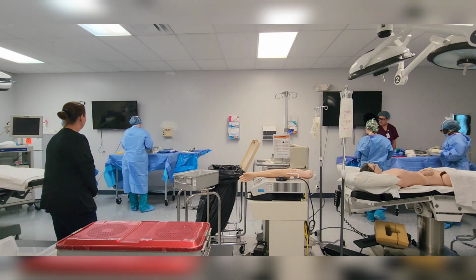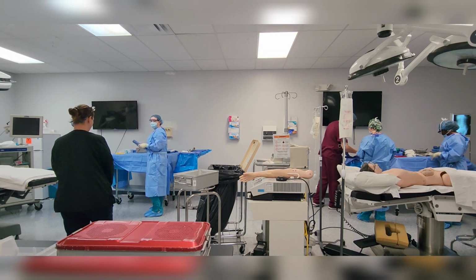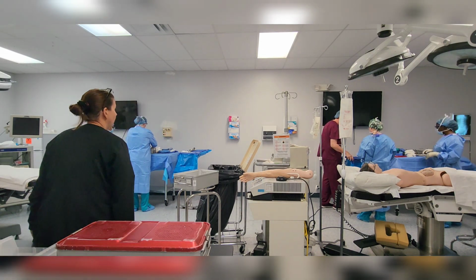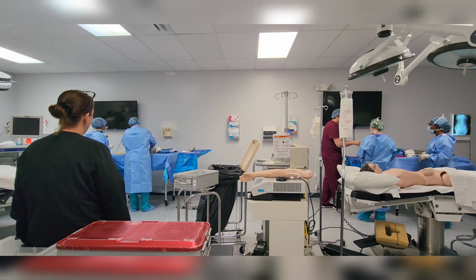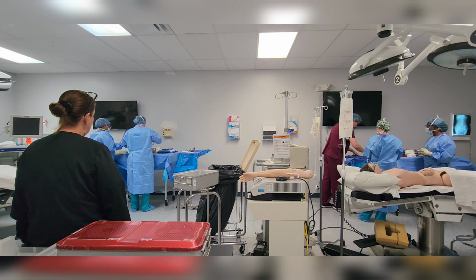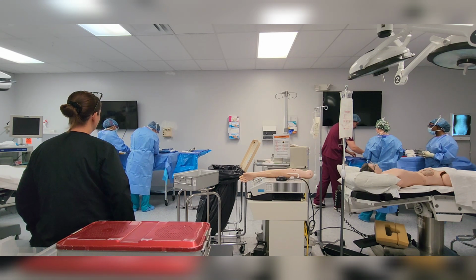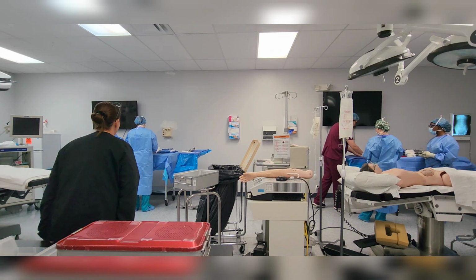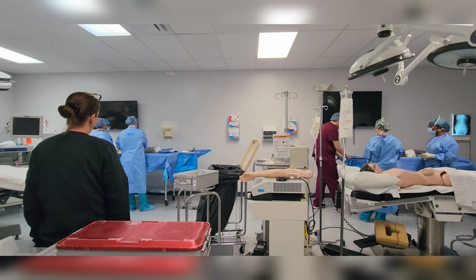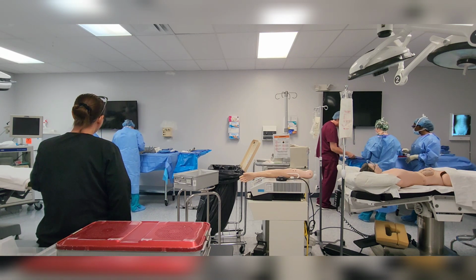Is this how you did yours different? Or did two towels? Oh, yeah. Sure, you guys work together, get your ties, get your Mayo stand set up. But I would have to move your ties out of there. But yeah, that's fine. I'm just going to hold that real quick. So if you're asking me how I did it, I like to just try to get the edges as best I can. You know, obviously try not to move stuff around as much. Once you commit to it, you stay, because the more you move things, people freak out. Why is that? Because stuff flies around. You can contaminate more, right? I try to have that down as flat as I can. And if you had an extra blue towel with the ties, you could put the ties probably under there too if you want, but it's up to you.